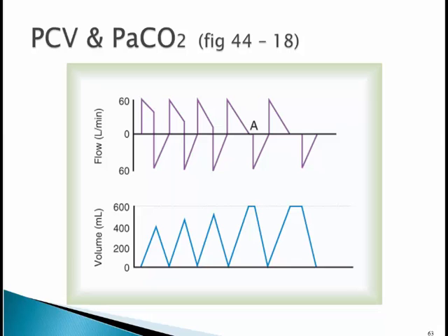The same effect occurs as inspiratory time is decreased. Initially, with small decreases in inspiratory time, there would be no change in tidal volume as long as an inspiratory plateau was maintained. When the inspiratory time is less than needed for an inspiratory plateau, further decreases in inspiratory time result in a decrease in tidal volume at the same pressure.